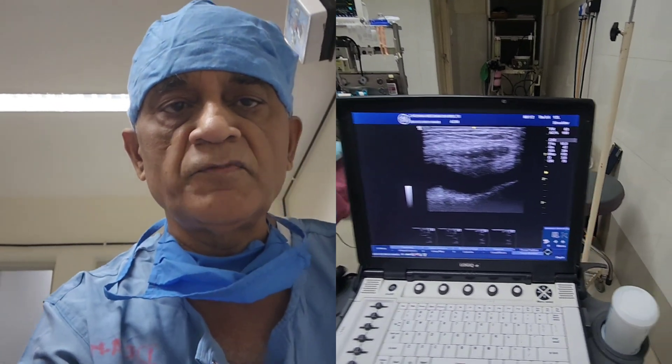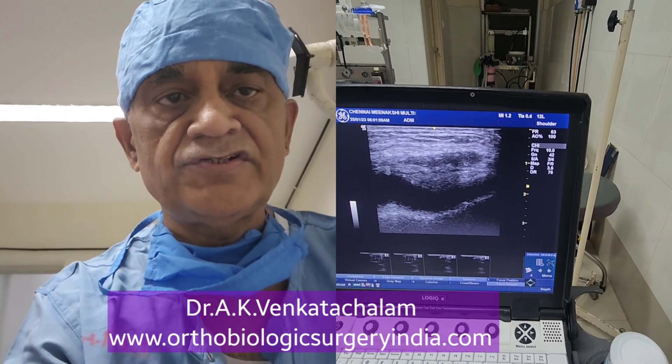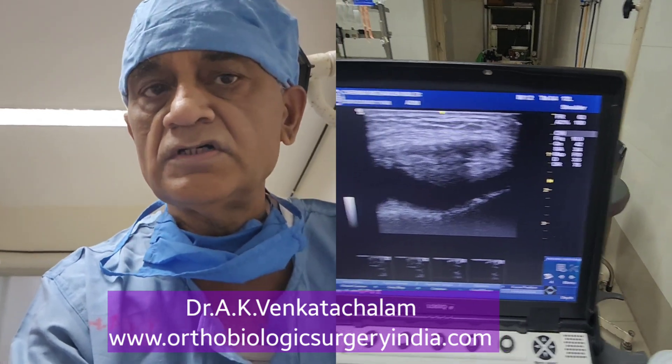Hi. Today, I am going to do an ultrasound guided aspiration and SVF injection of the knee joint.